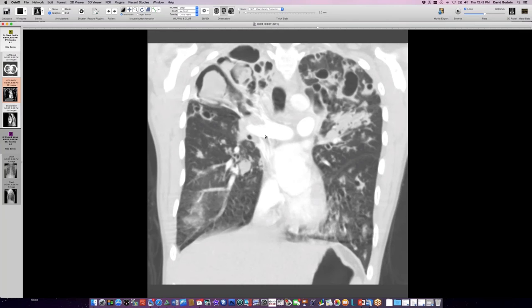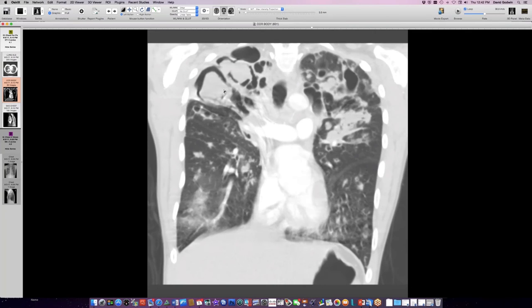It had this rounded top with chocolate coating the ice cream. So I've seen bronchi with that shape where they start out narrow at the hilum and then they just become bigger as they branch out toward the apex. And this has that kind of drumstick shape. So I think this is derived from bronchi. Ultimately, I think the bronchus probably breaks down and you just get a cavity, as you said.